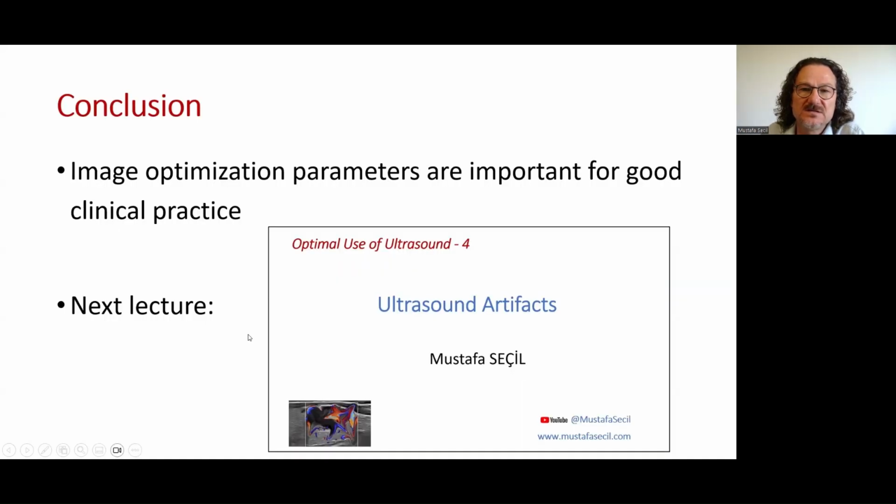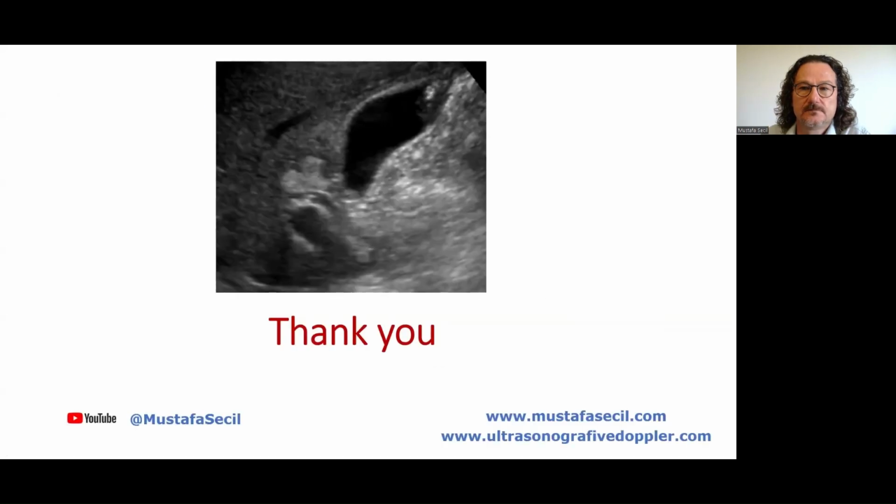Image optimization parameters are important for a good clinical practice. The next lecture will be about ultrasound artifacts. Thank you for listening.